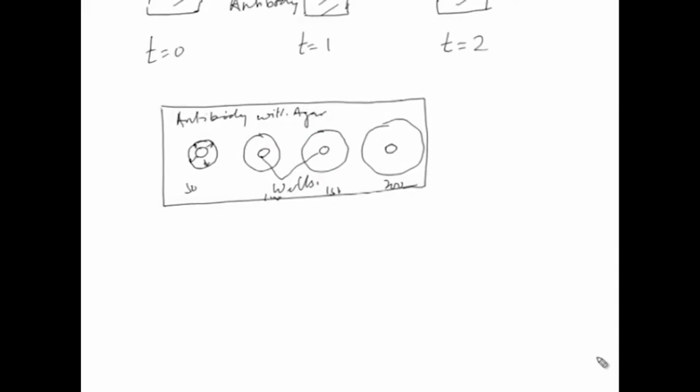As we have seen in here also, simple immunodiffusion also in one dimension. So, what you can do is you can always make a standard curve here, and this standard curve can be used for knowing the concentration of an unknown sample. So, this is simple immunodiffusion, and you can get precipitin lines which can be visualized. All right. So, this was simple or single immunodiffusion.